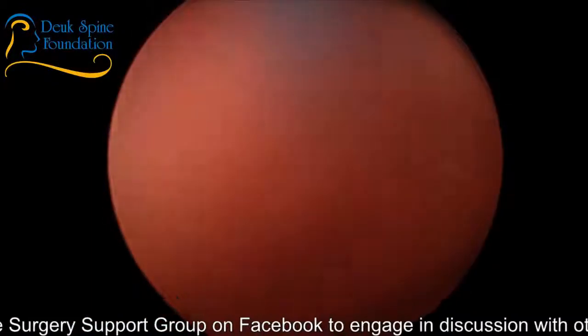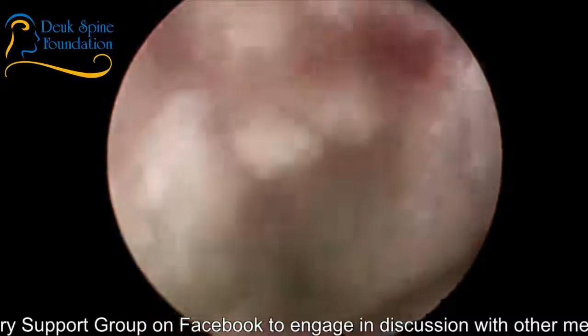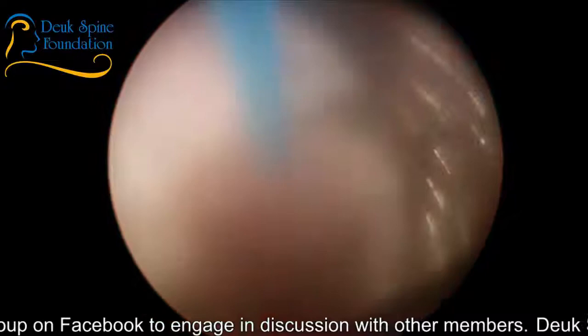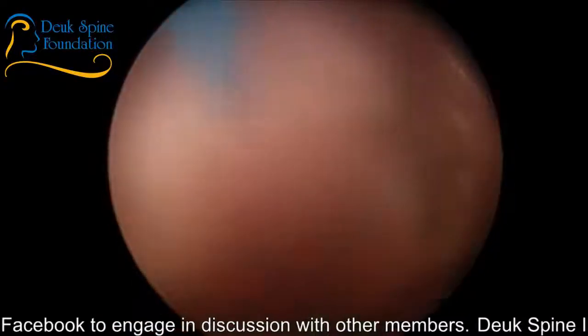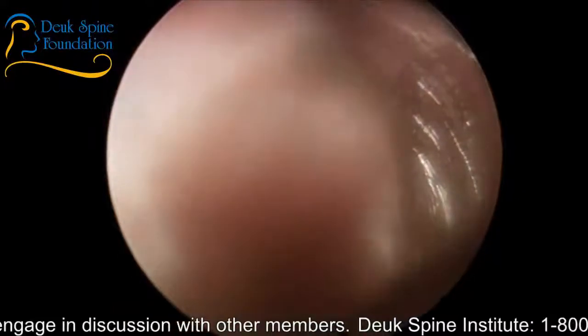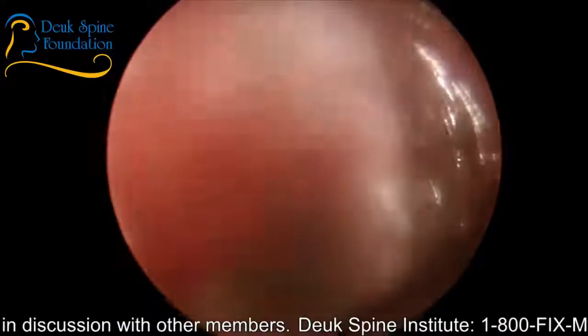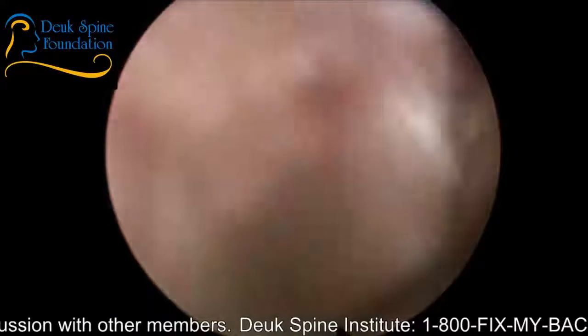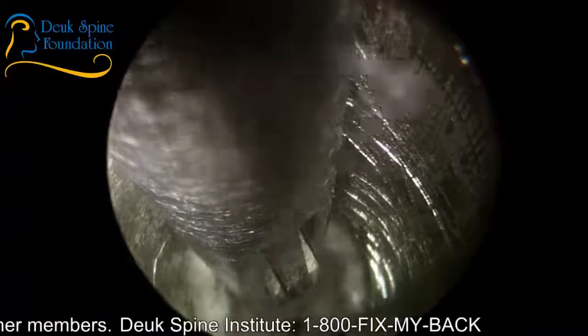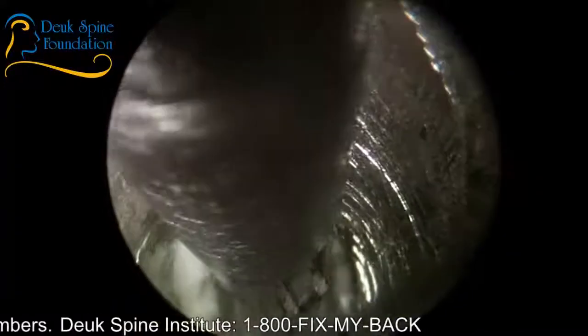Sorry about the poor view. So did I answer their question there? Stand by. Let's get the grabber in to see a little bit better. It's one of my tricks to see better. You can actually see how much better you can see when you don't have all that bleeding.